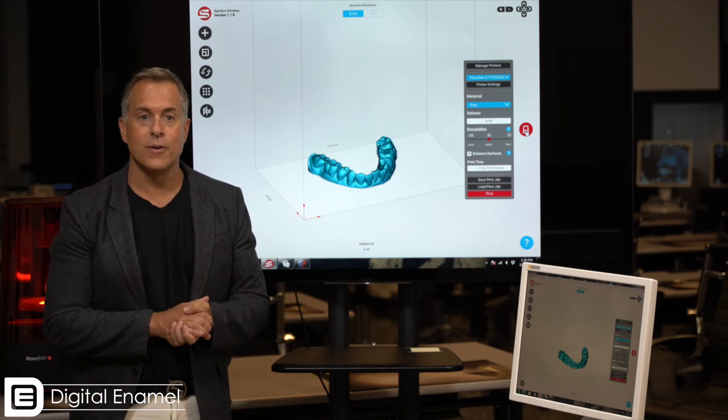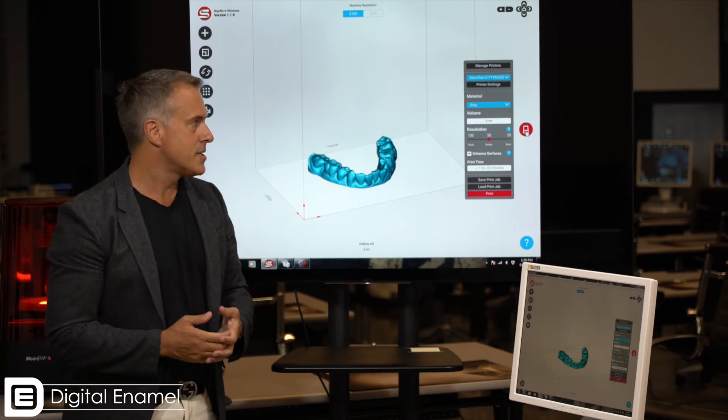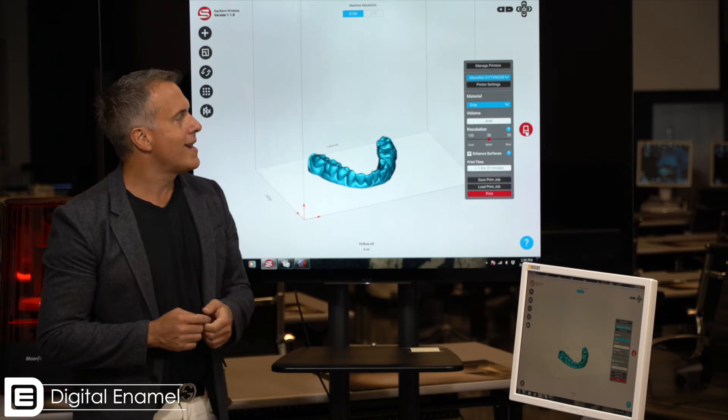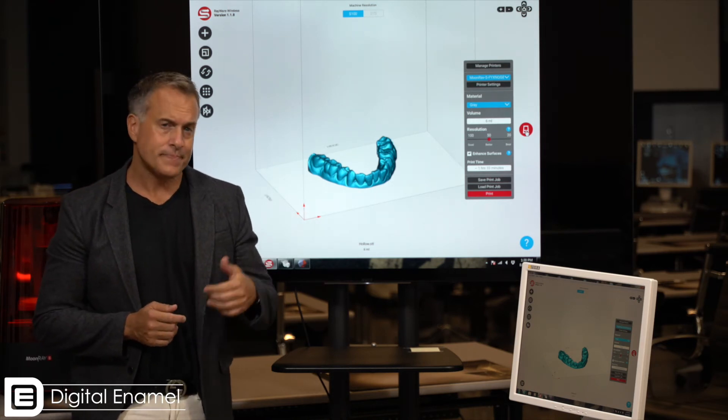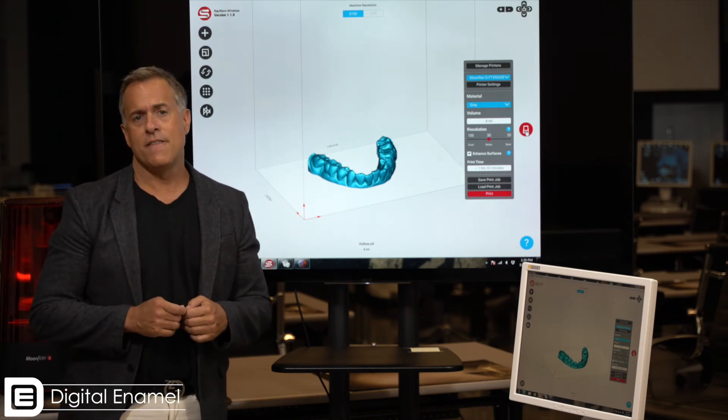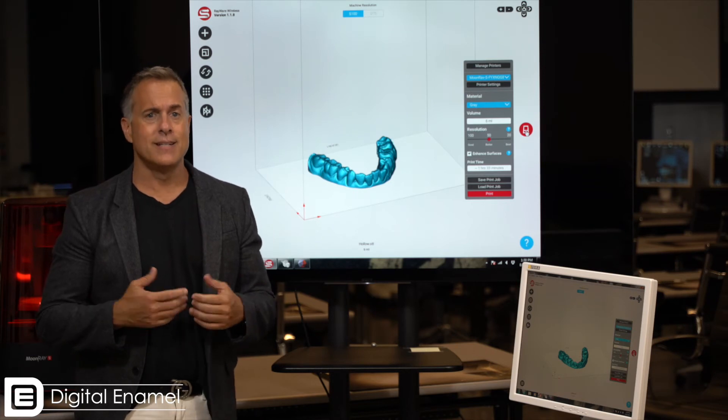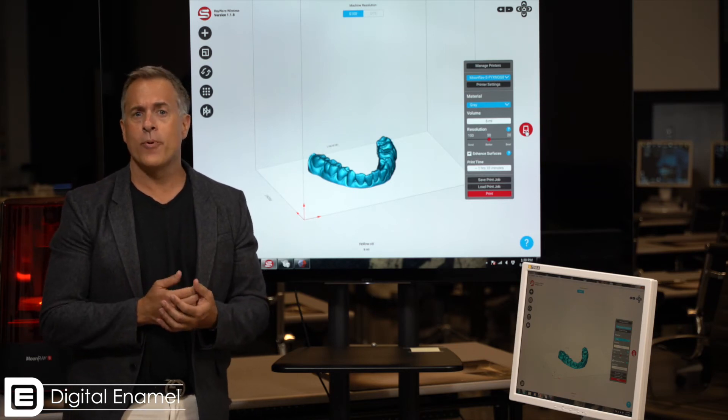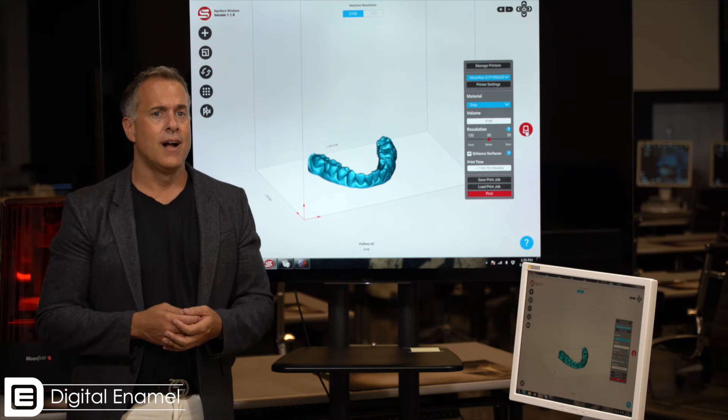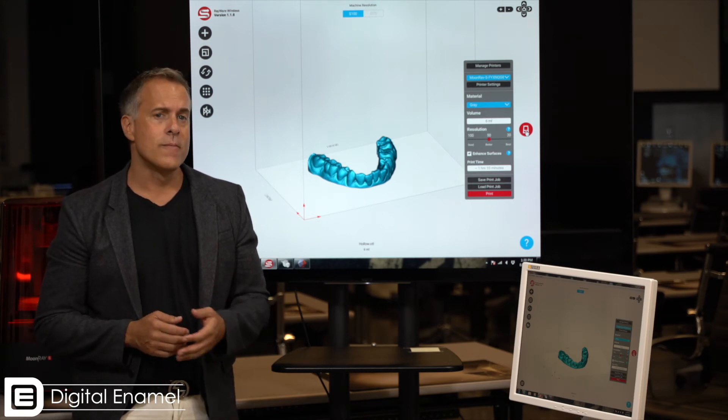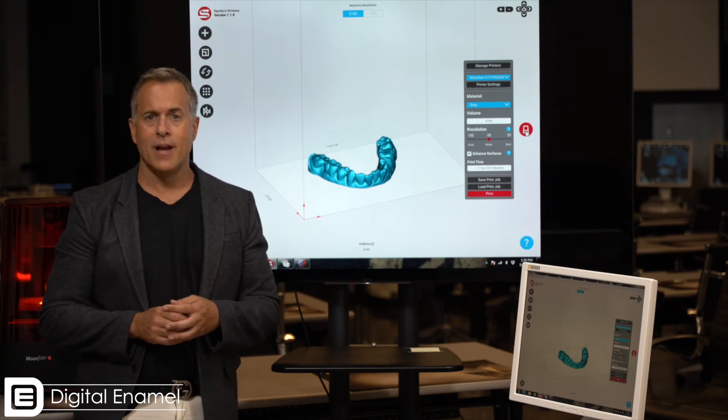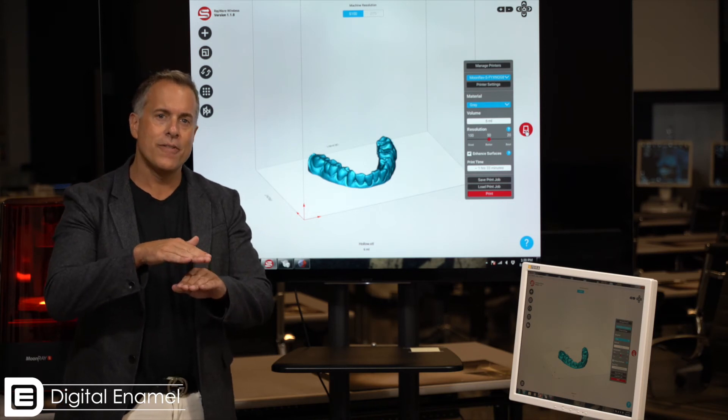So here we have resolutions of 20, 50, or 100. I select 50 if I'm printing something that needs to be a die. However, I'm printing something for aligners or to make a night guard, 100 microns is certainly acceptable. And that measures the layer height or how thick those different layers of resin can become.